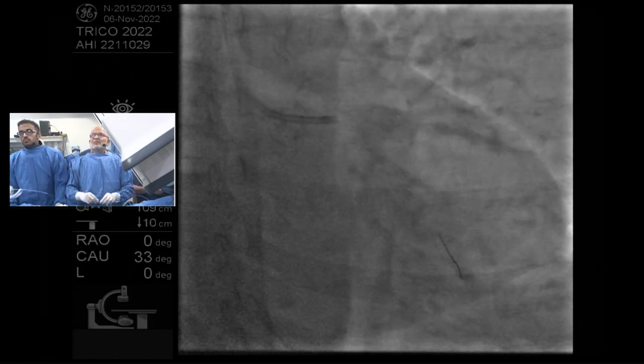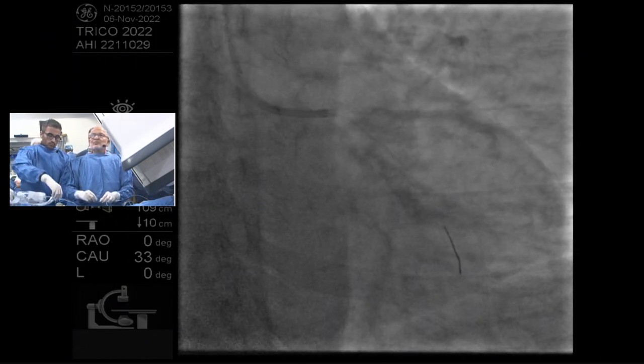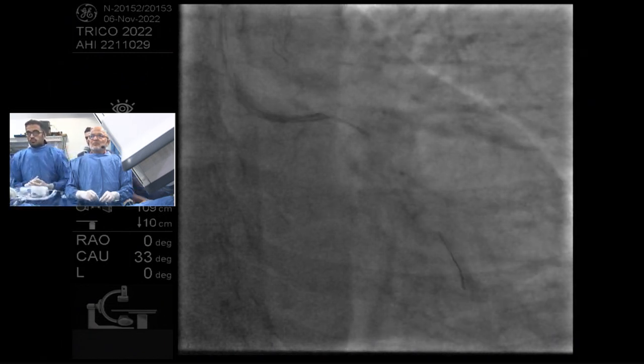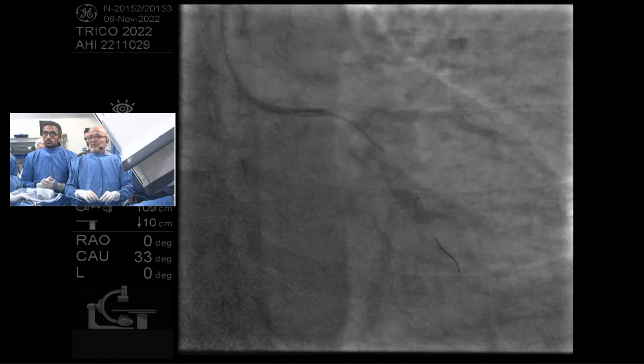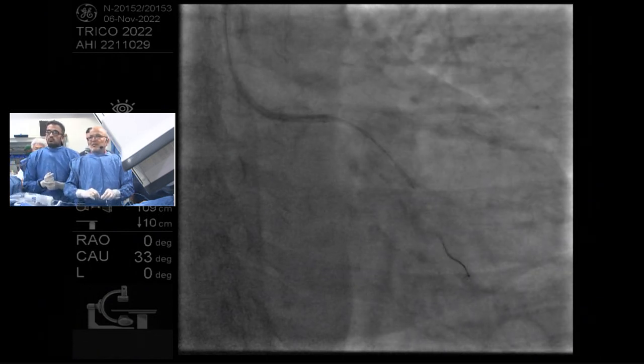Do you like to put a bumper wire at this moment so you know the ostium is well seen? What's that, sorry? Could you say that again? A bumper wire to the aorta. Yeah, the idea is that if you've got IVUS, you don't need the bumper wire, right? Because you're going to end up seeing the ostium on the actual image.